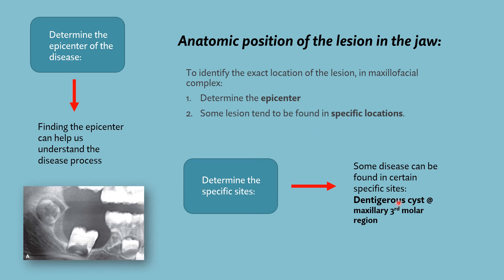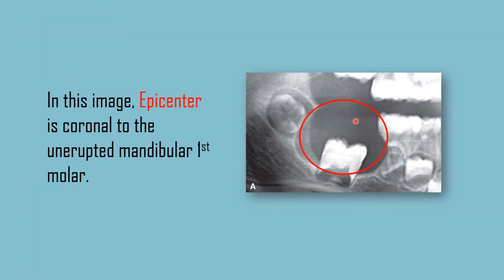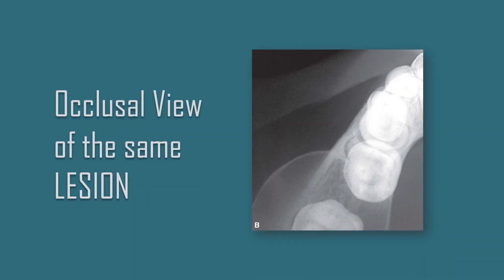Let's discuss this image. It shows an unerupted mandibular first molar, and the lesion is present coronal to it — so the epicenter is coronal to the unerupted mandibular first molar. When you see the second image, it is the occlusal view of the same lesion, where the epicenter is present occlusal to, or coronal to, the tooth.